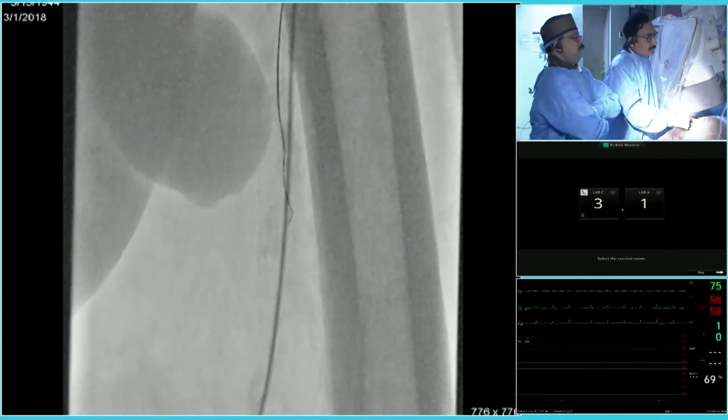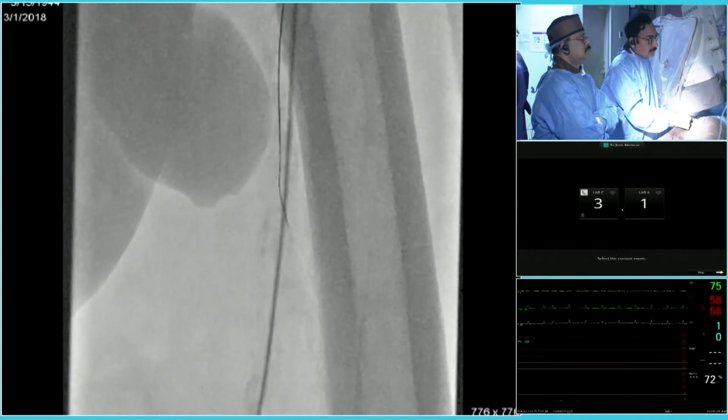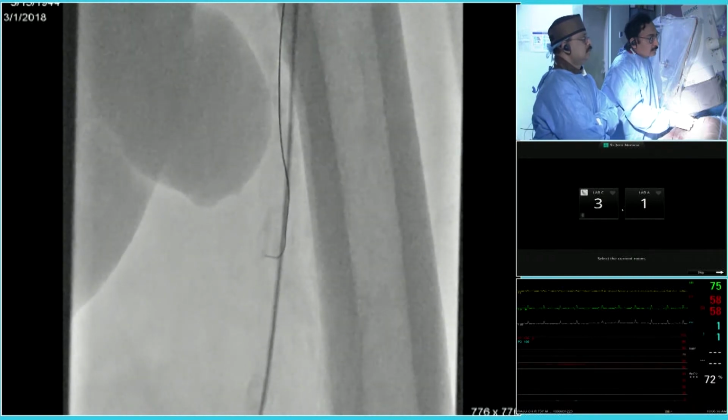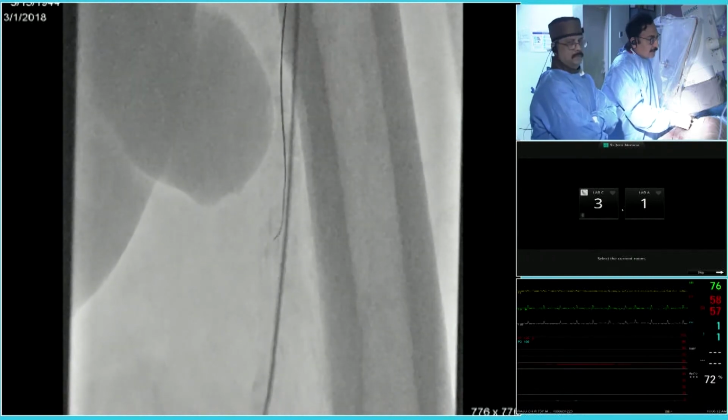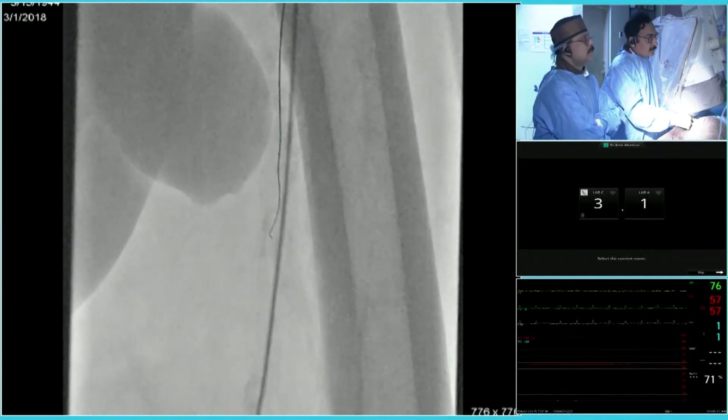Yeah. Either you can use a microcatheter, or, if those balloons still exist here, we always use over-the-wire balloons. A 2 millimeter over-the-wire balloon. You can take the wire out, inject a small amount of contrast, or take a microcatheter through the center lumen, and you can easily go down the vessel.